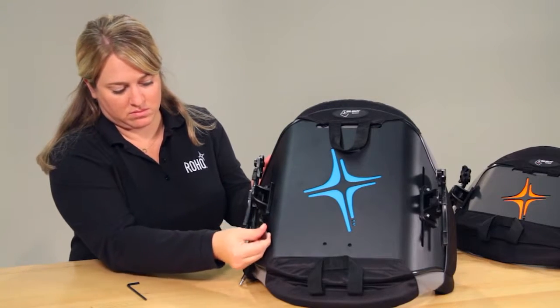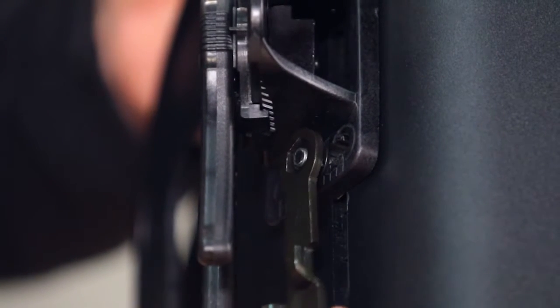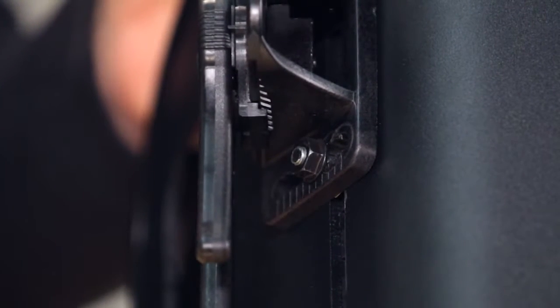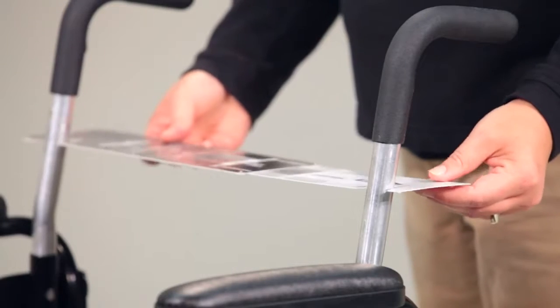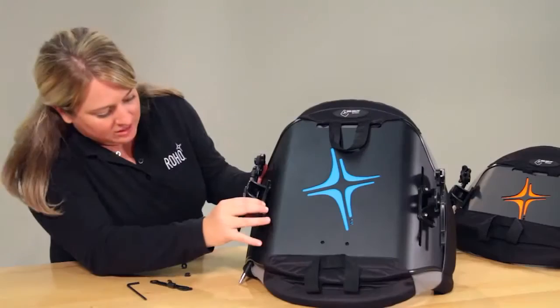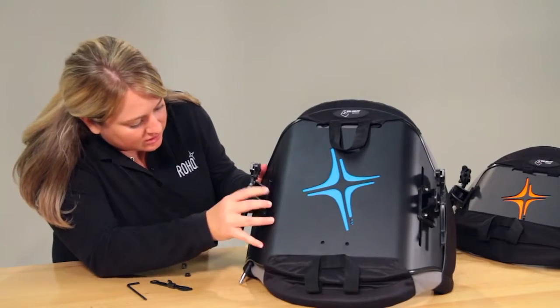Remove the nuts at the end of the width and height adjustment bolts with the box end wrench. Detach the triangle brackets from the back shell. Position the triangle bracket on the tick mark that you measured using the slide rule. Replace the nuts on the width and height adjustment bolts.